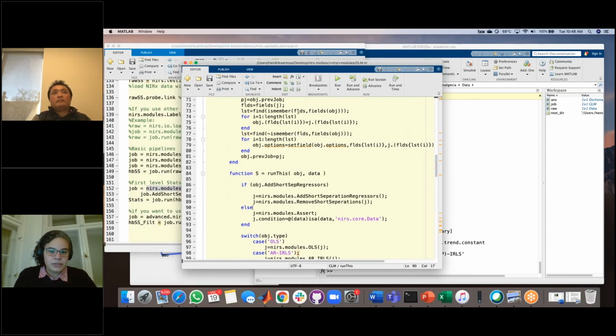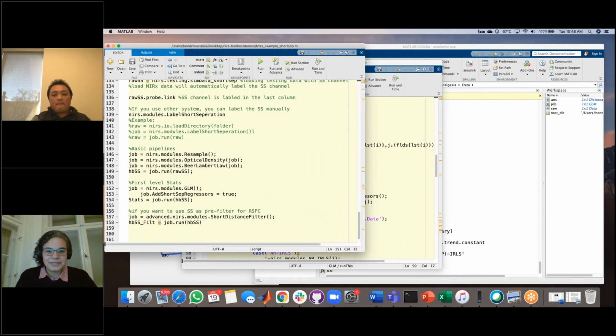Apart from having the option in the toolbox, we also have Ted in the audience there, and he can add on top of your answer. The combine section uses both time courses from oxy and deoxy as regressors in the model, right? So you're not just using oxy or deoxy, you're actually combining both and using them in the GLM as regressors. Okay. I mean both oxy and deoxy, or either oxy or deoxy. Yes, so you can choose, but what you show in the paper is that when you use the combination of both as regressors, it's actually better. Better, yes. Okay, thank you very much. Thank you, Ted, as well.